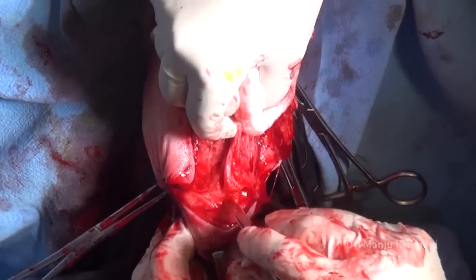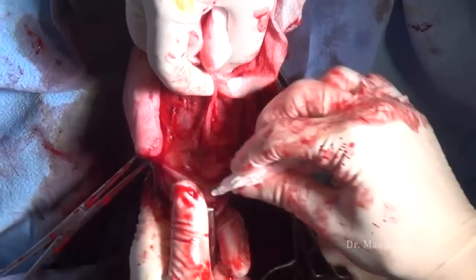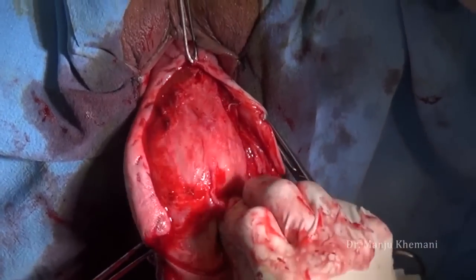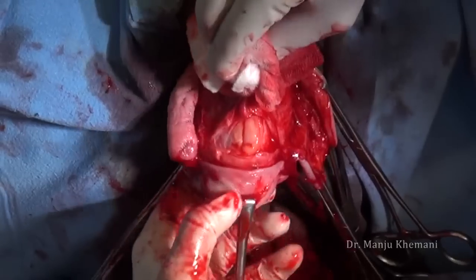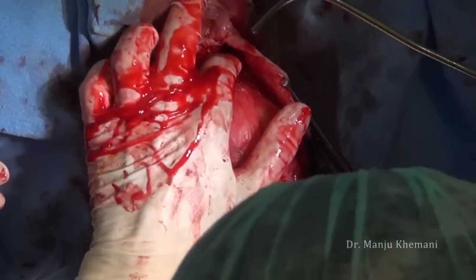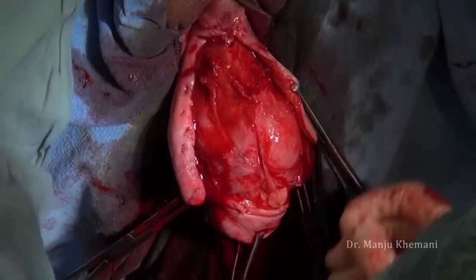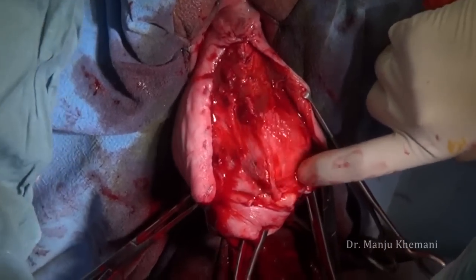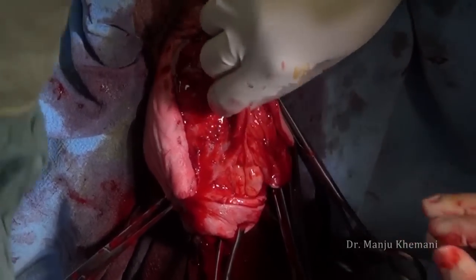After I had made the cut and was pushing it up, I realized I was seeing fat — fat belongs to the bladder — and that's how you know you've got into a layer of the bladder. Put a sound to ascertain this. This patient was on warfarin because of atrial fibrillation, which was stopped one week before surgery, yet she had much more bleeding than normal. The bladder sound confirmed I was slightly on the wrong plane, and this saved the bladder from injury.